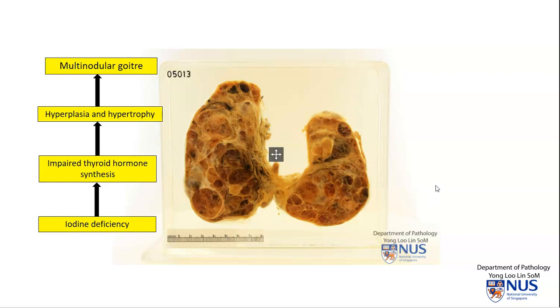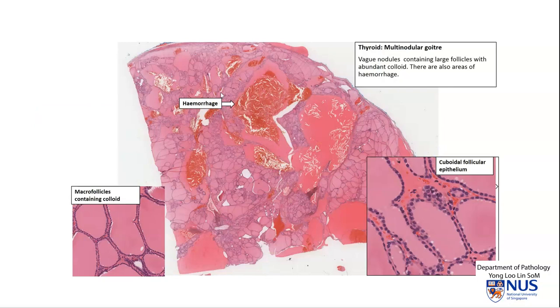Microscopically, we would see multiple nodules. You can see that there is a vague nodule here that is not encapsulated. Within each nodule, we will see multiple follicles. Some of the follicles are very large and contain abundant colloid. Other follicles are smaller, and the lining epithelium can be cuboidal, as we see here, or it can also be a little bit more hyperplastic, meaning that the cells are more columnar.